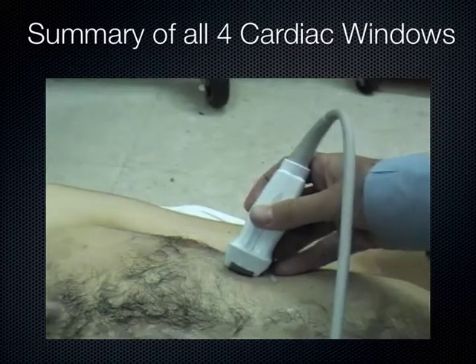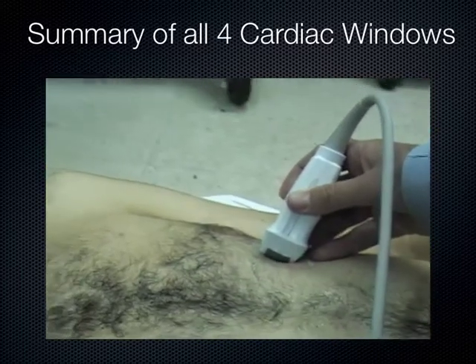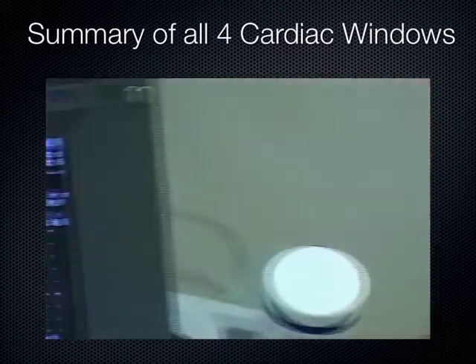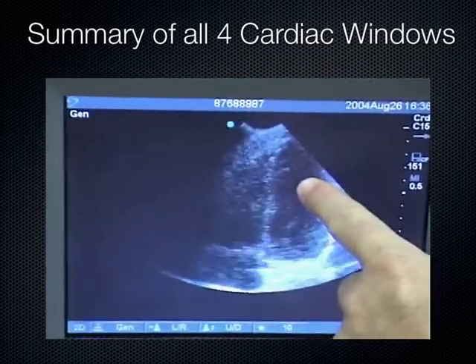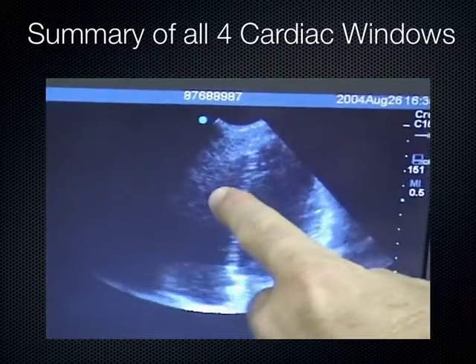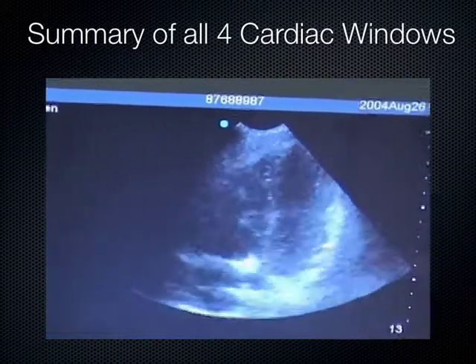You're sort of right underneath that left nipple, aiming towards the spine. And that view there will get you the heart on the screen to stand straight up with the septum standing top to bottom. That's the septum there. This is the left ventricle, right ventricle. Notice how the right ventricle is about 2/3 the size of the left ventricle, and that's normal.